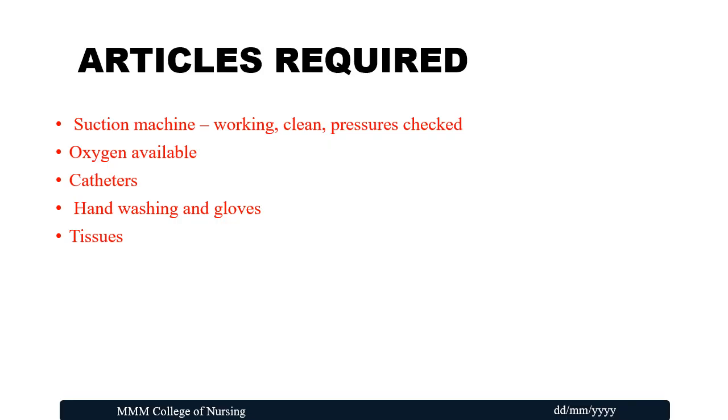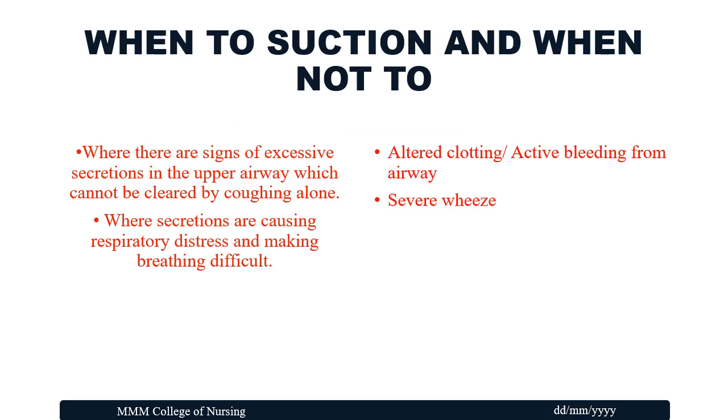Articles required are a suction machine, working and clean with all the pressures checked, oxygen available, catheters, hand washing and gloves, tissues if required. Okay, when to do the suction and when not to do the suction.